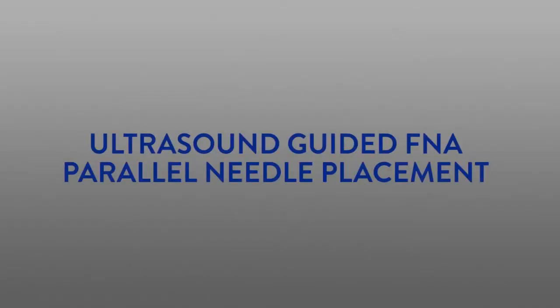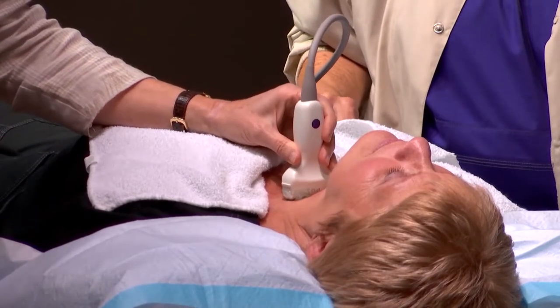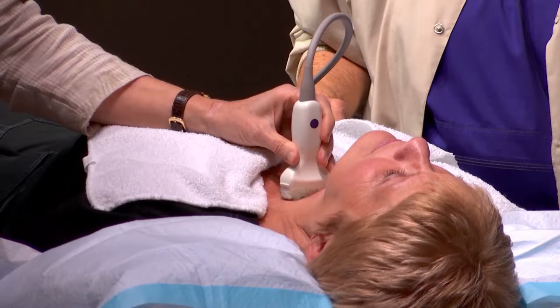Parallel Needle Placement. Place the probe on the skin above the target with a clear path for the needle to penetrate the target. Make sure your hand is supported to facilitate maintaining steady probe position.